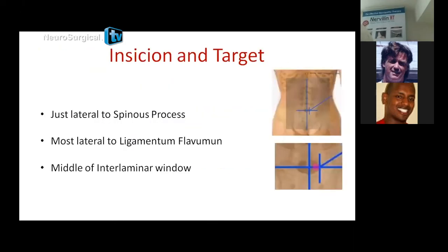To have it tight means as if I'm standing like this. Yeah. Flexion, flexion, flexion. That's why the window is open in that case. Yeah, the vertebra is, yeah.